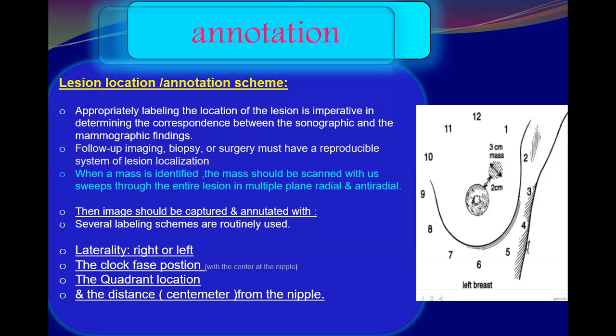We have to describe at what o'clock. Sometimes we can mention even the quadrant. If we mention the clock, that means it's understandable. Sometimes they describe by quadrant locations, and sometimes they also use the distance from the nipple, which is more constant.